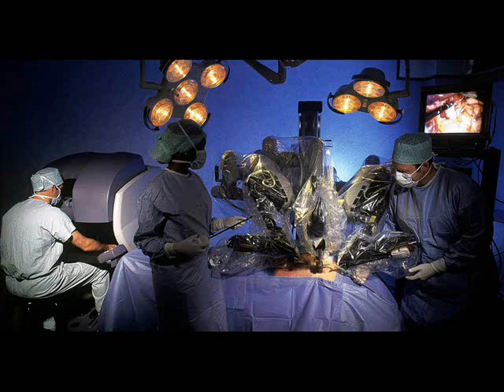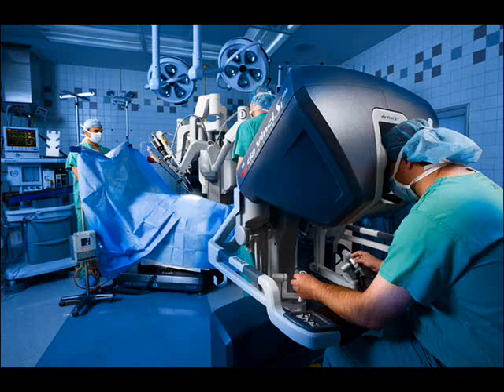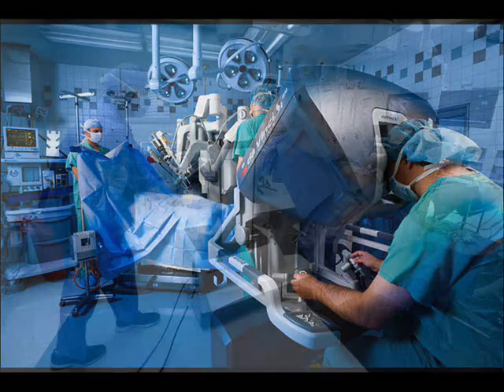In the case of enhanced open surgery, autonomous instruments replace traditional steel tools, performing certain actions with much smoother, feedback-controlled motions than could be achieved by a human hand. The main object of such smart instruments is to reduce or eliminate the tissue trauma traditionally associated with open surgery without requiring more than a few minutes training on the part of surgeons. This approach seeks to improve open surgeries, particularly cardiothoracic, that have so far not benefited from minimally invasive techniques.